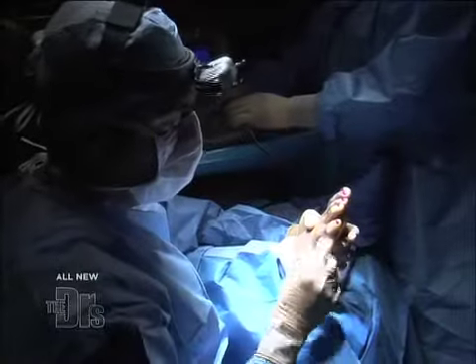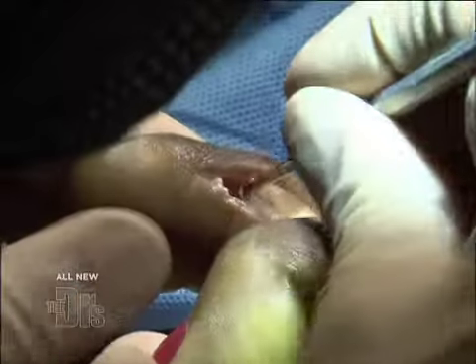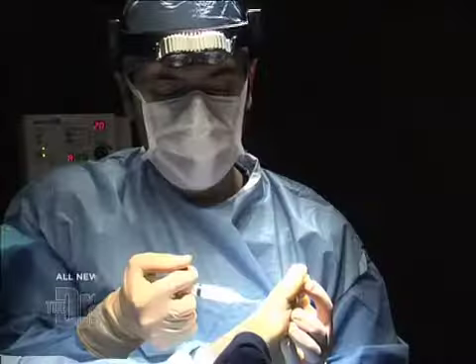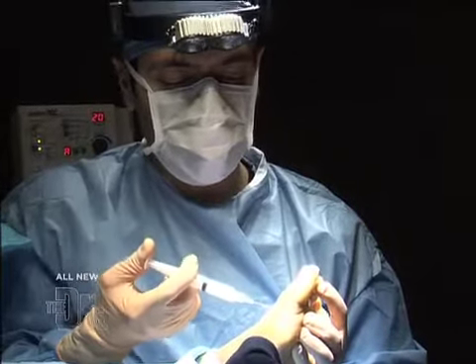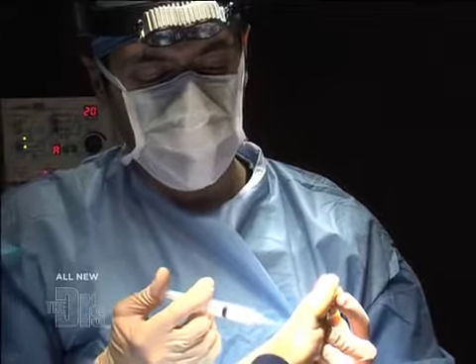All right, so now we're going to do a tailor's bunion. We cut the bone, we shift it over so the angle is corrected, and then we reattach it with a screw. All right, so we're going to start on the second foot. Case went great, nice and smooth. She did very well. The toe is perfectly positioned and aligned, and she's going to be very happy.